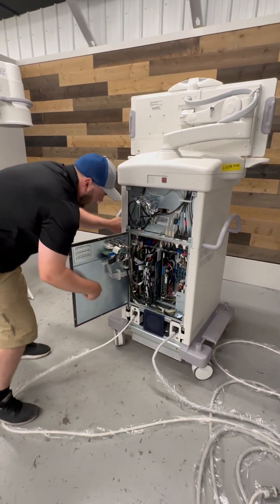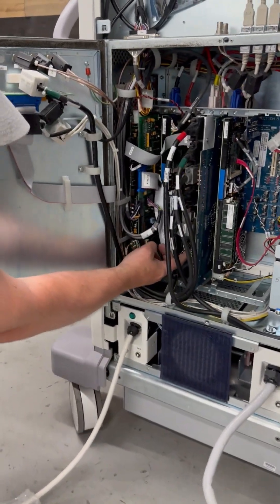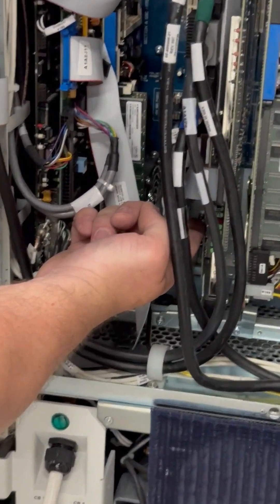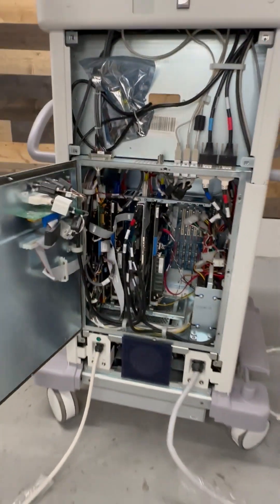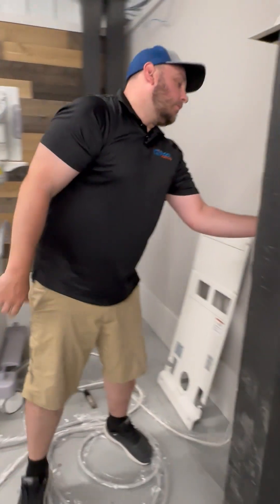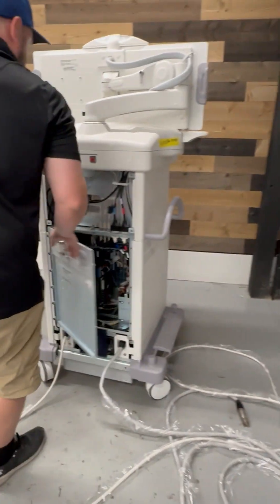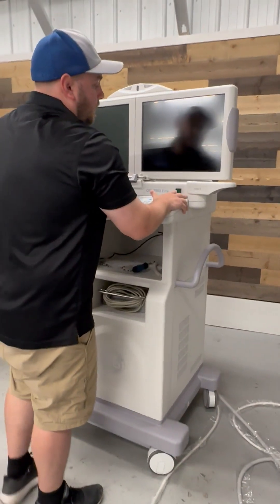On your display adapter, on the very bottom, there's a little silver dip switch. We're going to want to flip that up and then plug our workstation back in and power the system on.